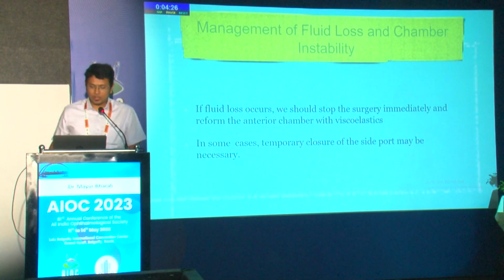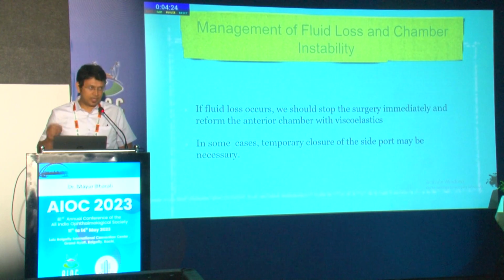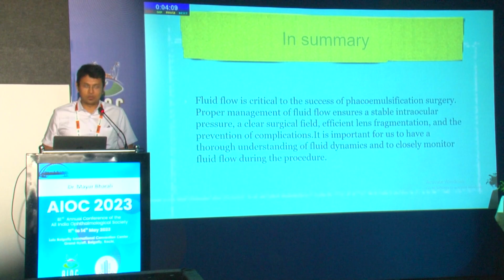If fluid loss occurs, we should stop the surgery immediately. Now, if it occurs like in my previous video, then in that scenario we should stop. We should not use that side port, and we should make another side port from another paracentesis, and then we should proceed. Sometimes we have to close that side port also by giving a suture.